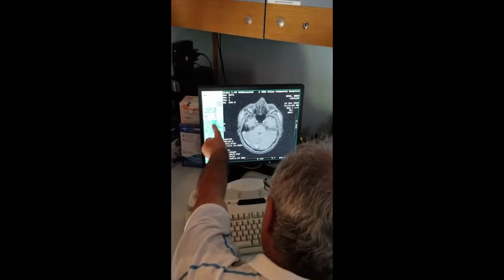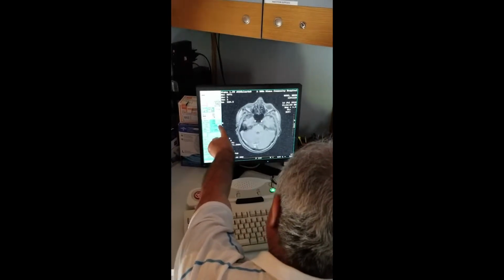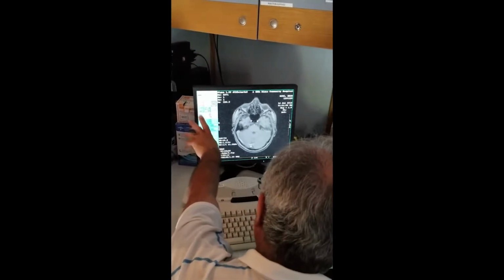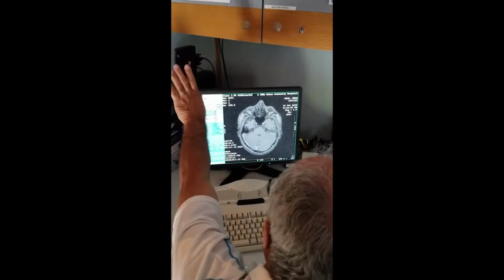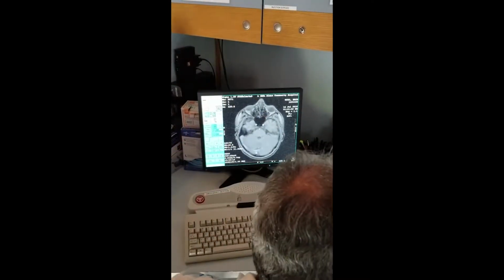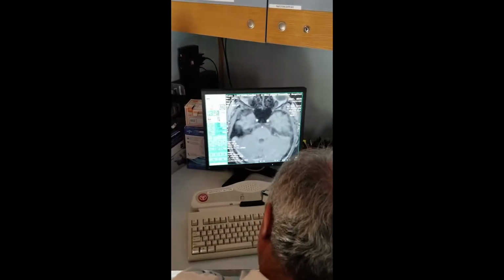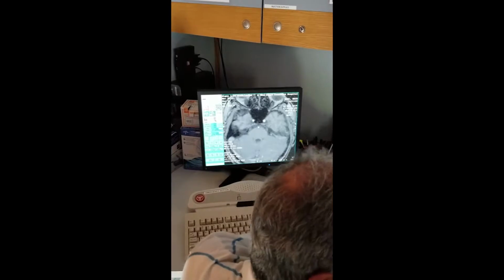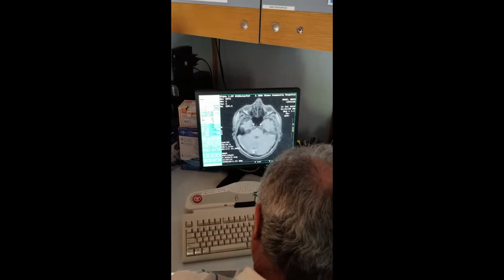Next exam, previous exam. Next series, previous series. Next image, previous image. Zoom. What is it zoom on? 1. Zoom at 1.1. One click, for crying out loud. Don't grab this. When you grab this, see, you don't have the control in your hand. So just zoom by clicking.